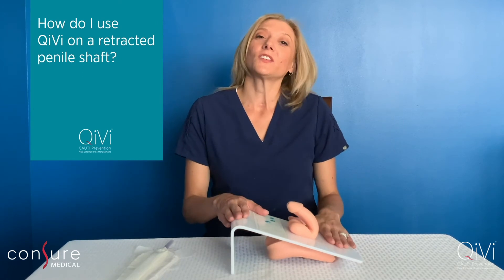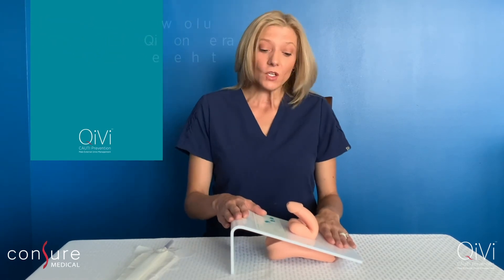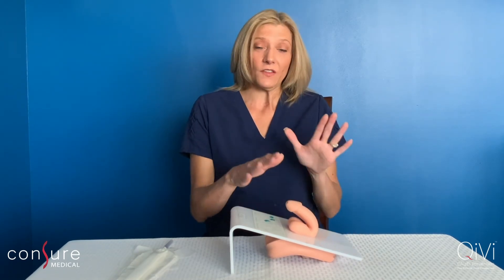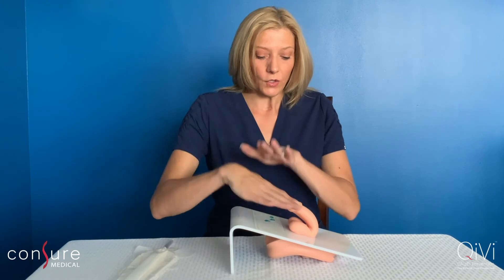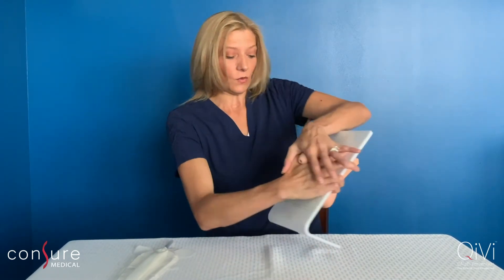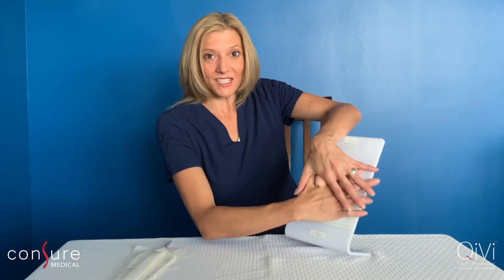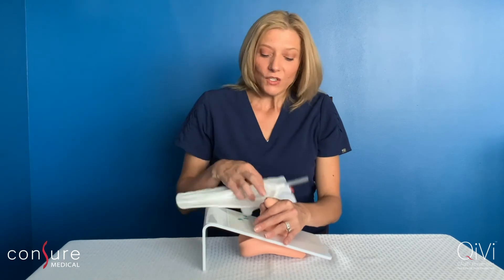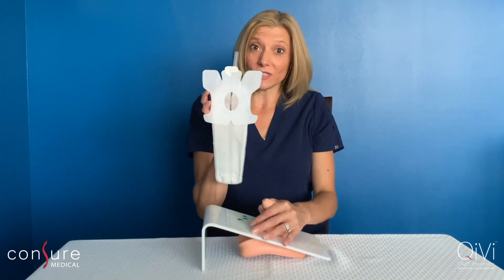I wanted to take a minute to show you how to use the QiVi device on the retracted anatomy. Your goal on the inverted penis is not to find the shaft but just to find the urethral opening. You're going to do your best to find that urethral opening, and after digging in there, you're going to get something that looks very similar to this — and that's fine, that's all you need. You're going to take the device using the urethral opening as your dart and the device center as your bullseye.